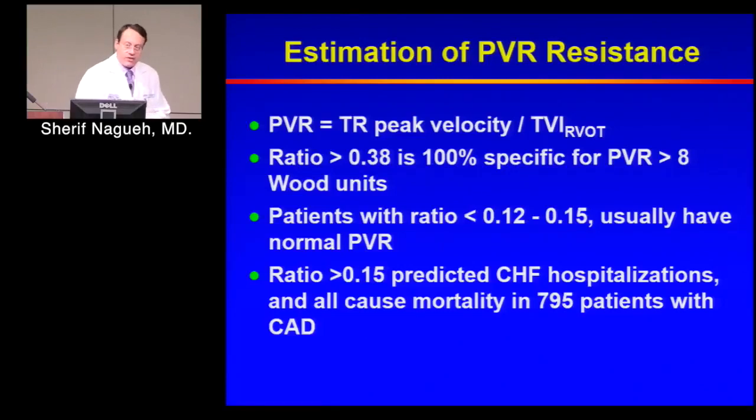That simplification at its first look makes sense, but what are the problems with this simplification? The problem is the TVI is not the same as the cardiac output or the stroke volume. We need RVOT diameter. So you can have different size hearts where the TVI is small, but the RV outflow tract is wide enough that the stroke volume is normal, not reduced as you would have inferred just based on a reduced time velocity integral. The second one, this is 4V squared, doesn't even have the RAP added, and we just said we need the mean PA pressure, not the PA systolic pressure.